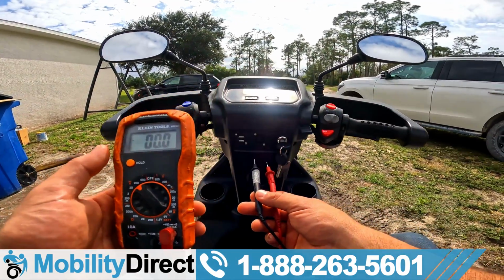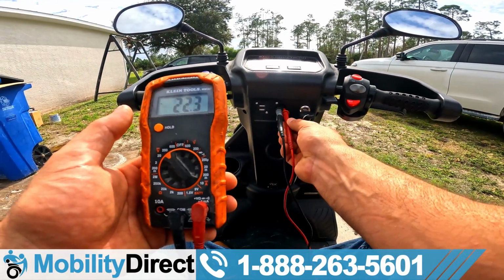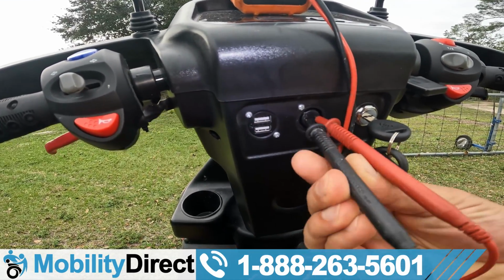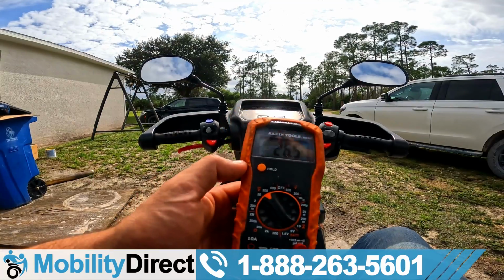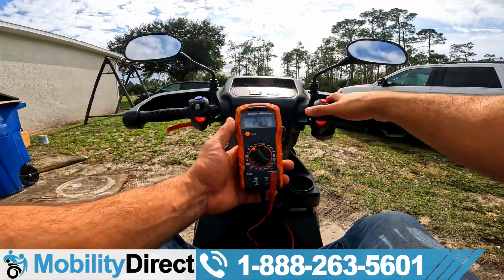And what I'm going to simply do is use the charging port. You can put one probe in the left hole, one probe in the right hole of the XLR charging port. It has 3 holes. It's a 3-pin barrel connector charger. You're probably familiar with it. And you can just get voltage right from the charging port. So you can see here, I've got 26.5 volts, right? And that's all good and well.